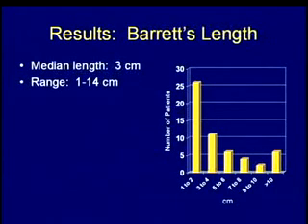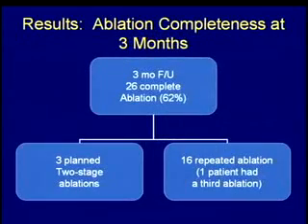So these are the results. The median length of Barrett's treated was 3 centimeters with a range of 1 to 14 centimeters, and the vast majority are in the 1 to 4 centimeter range. We had 45 patients that we did endoscopy at 3 months. However, 3 of these patients had a planned 2-stage procedure because their Barrett's was greater than 6 centimeters, and so we decided to ablate those at 2 separate procedures. So of the 42 patients, we had 26 with complete ablations, an ablation rate of 62%. 16 patients had repeat ablations, and 1 actually had a 3rd ablation done.